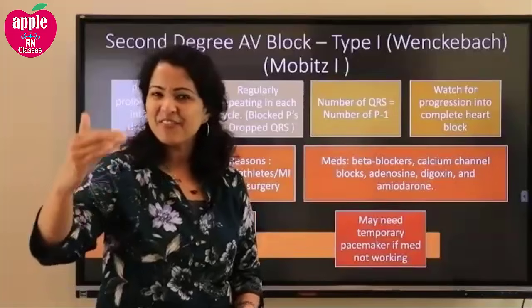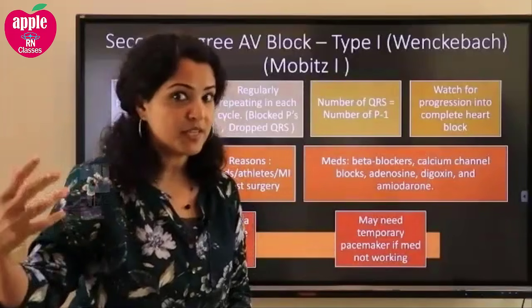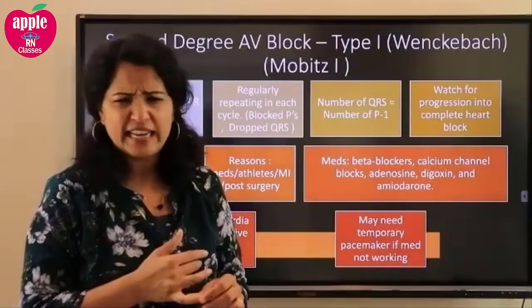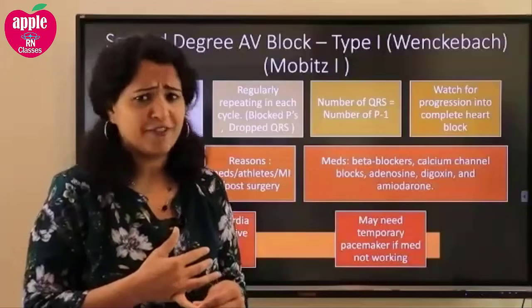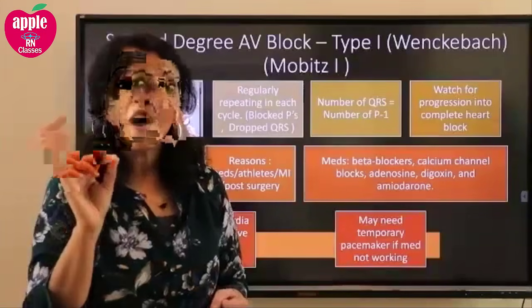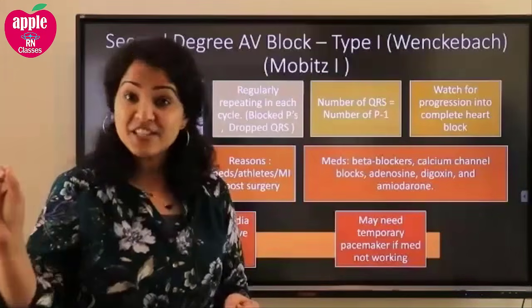So that's kind of a schedule which the wife is observing now. And she knows there is something else to it. It's not just any projects or traffic. There is something more going on. I mean, she is getting that. So what is going to happen to the PR interval here?